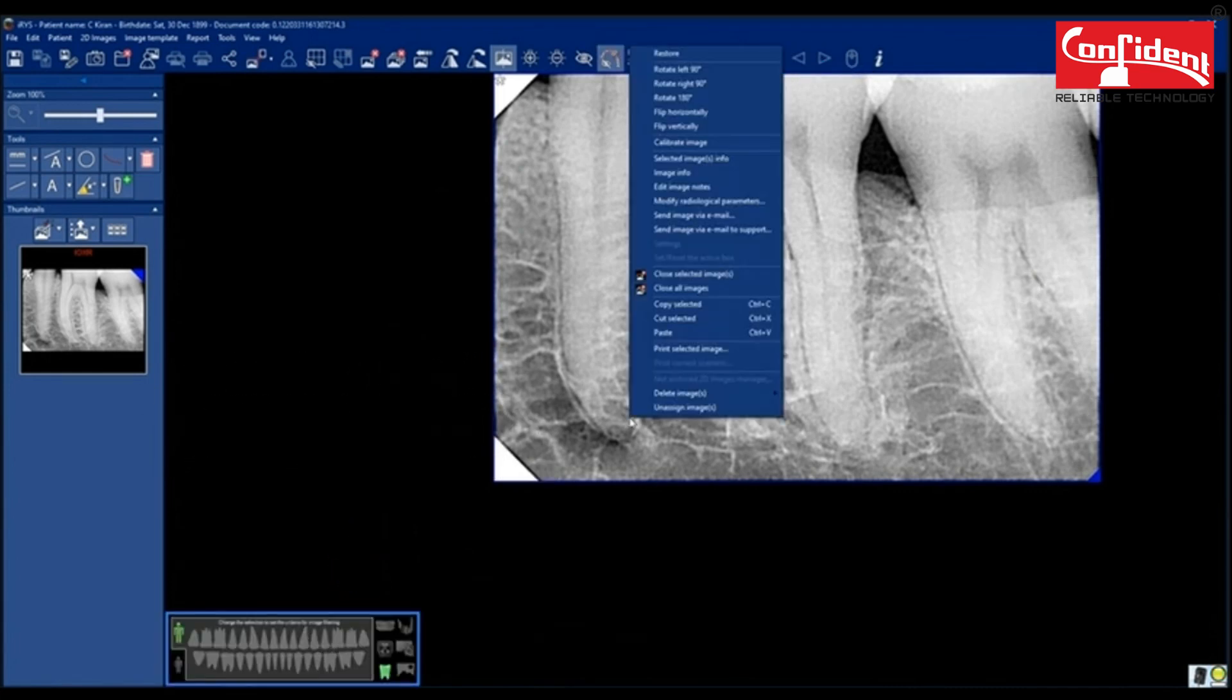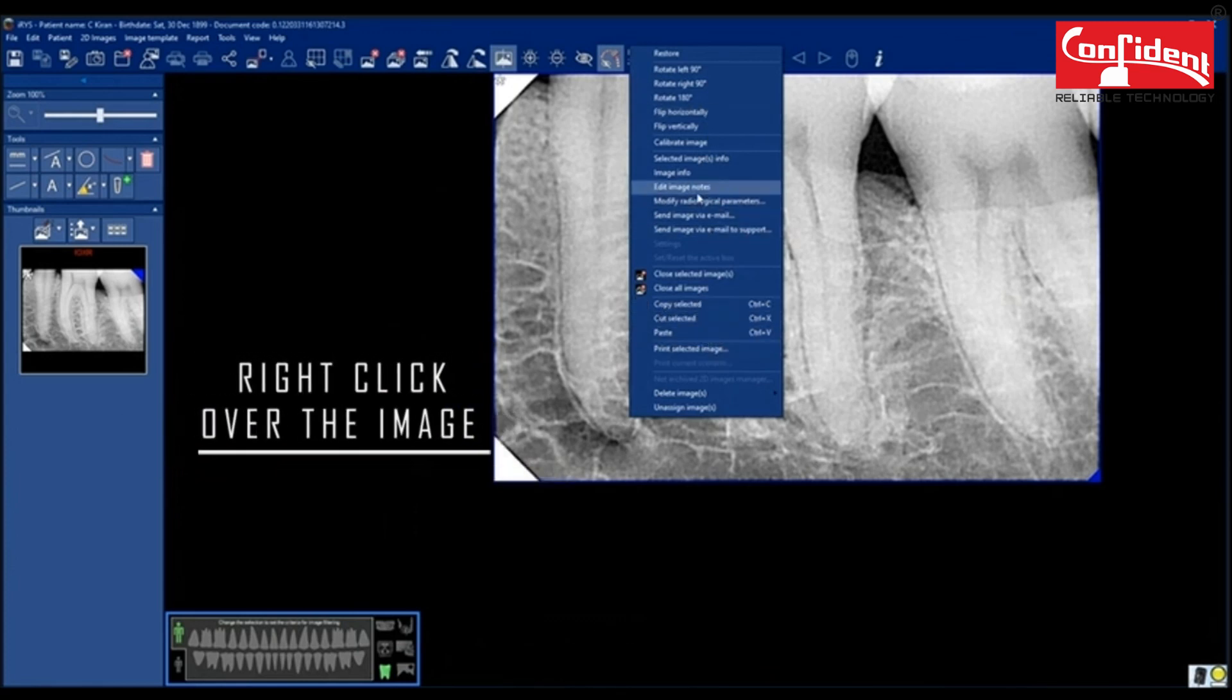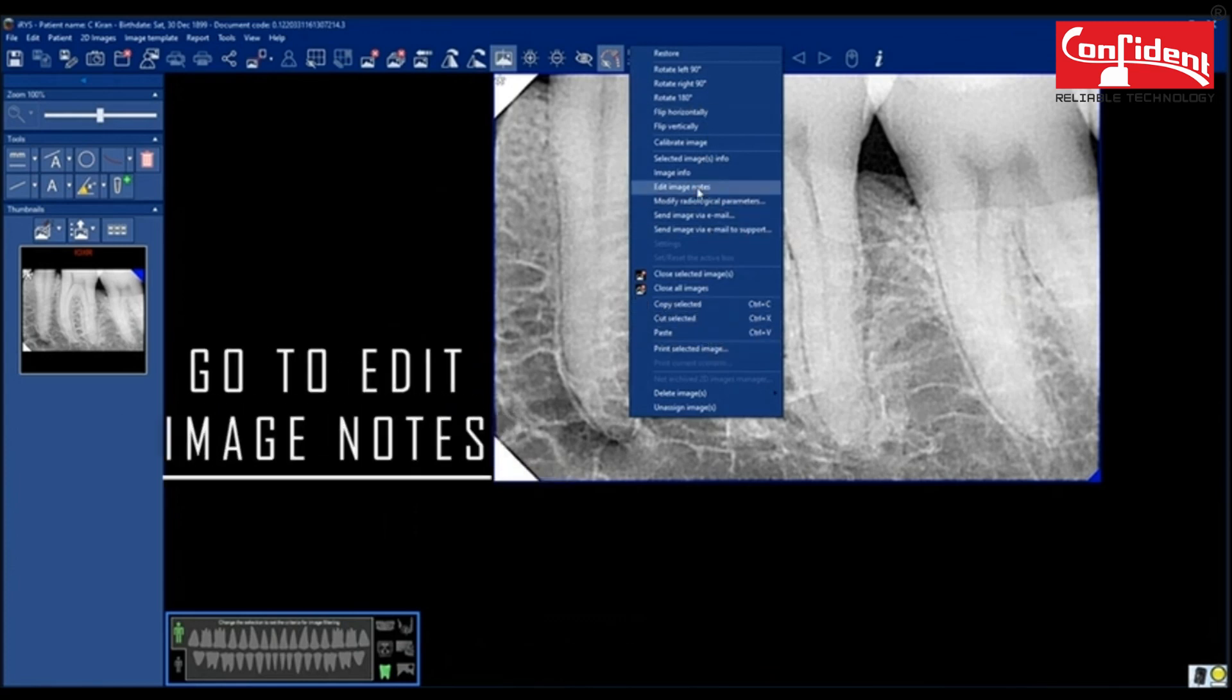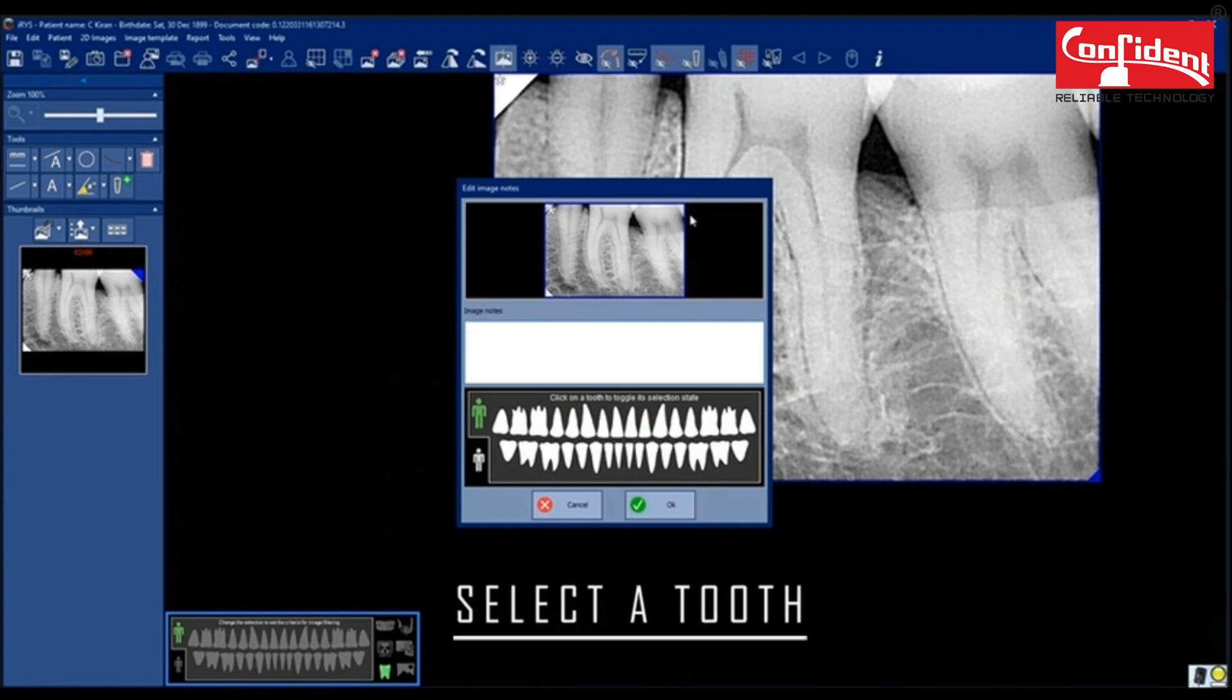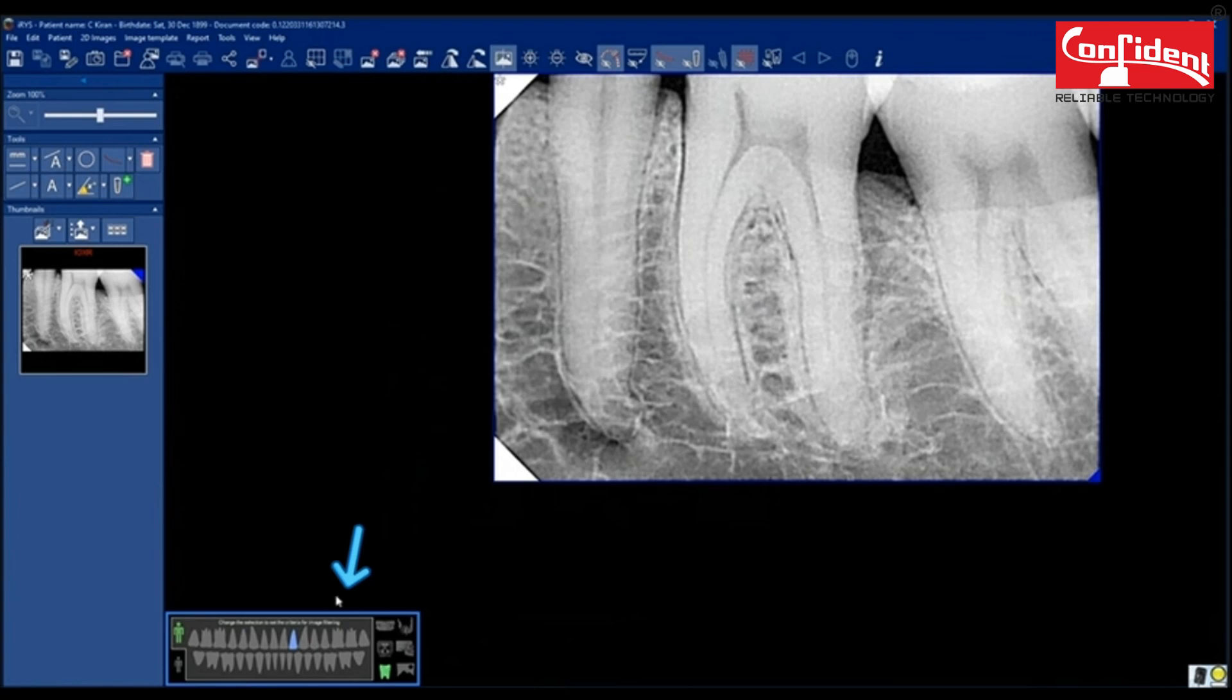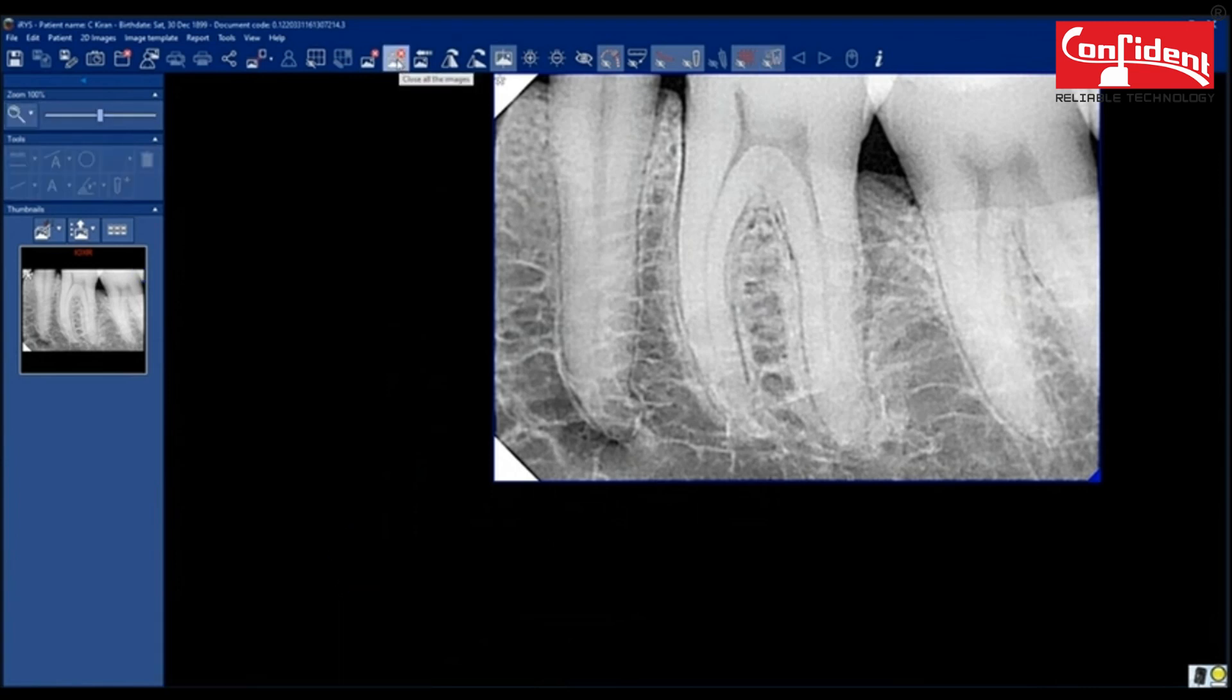In order to assign a tooth to the image, right click over the image, go to Edit Image Notes. Select a tooth from this chart. You can add notes if any. Now you can see the selected tooth in the chart.